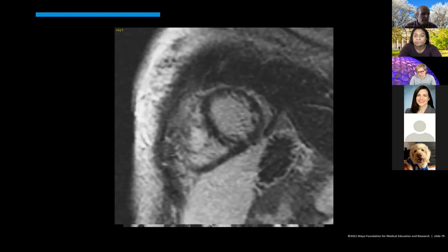For whatever reason, I don't know the answer to this, but in my experience, patients with cardiac sarcoid typically will present with heart block as opposed to ventricular tachycardia, whereas patients who have mid-myocardial scar from prior myocarditis are more likely to present with ventricular arrhythmias.